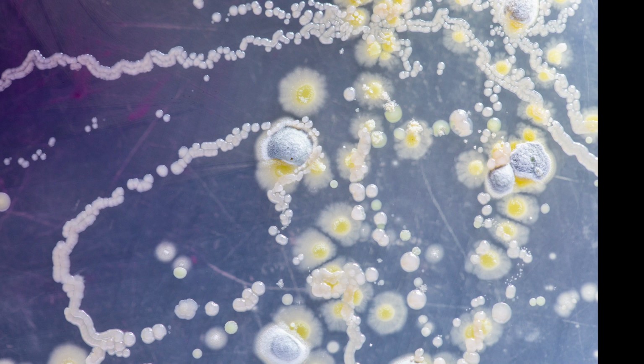And for this particular test, we also recommend that you incubate your plates for 24 hours before reading. And the reason for that is that after a longer incubation, 24 hours, instead of the standard 16 to 20 hours, it's easier to differentiate between the sharp and fuzzy zone edge. And here we again have an example of where it's very, very important to streak the plates carefully.